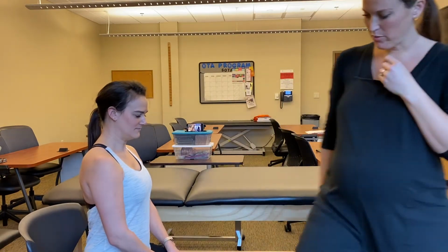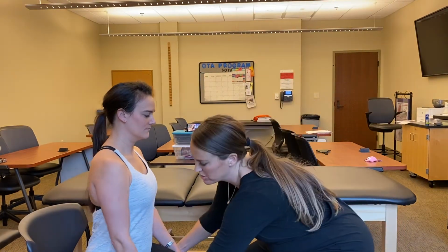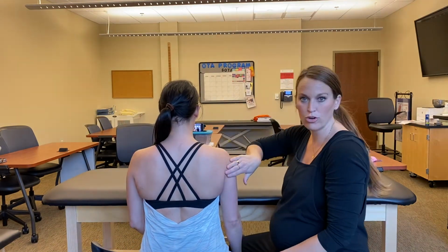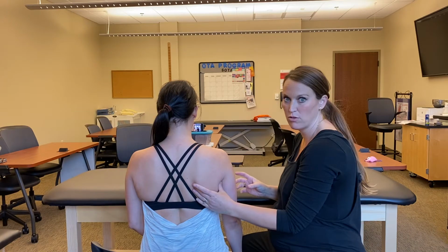So we're gonna start with shoulder flexion, and it's important to note, and I'm gonna just turn you towards the camera here. When we're doing any kind of shoulder movement, the scapula is moving as well.